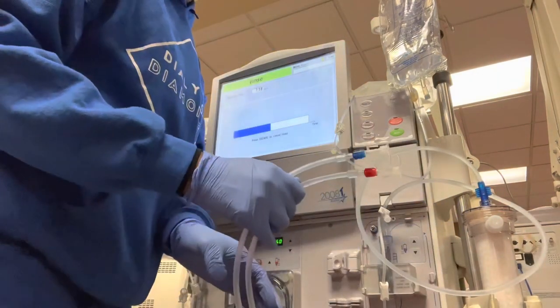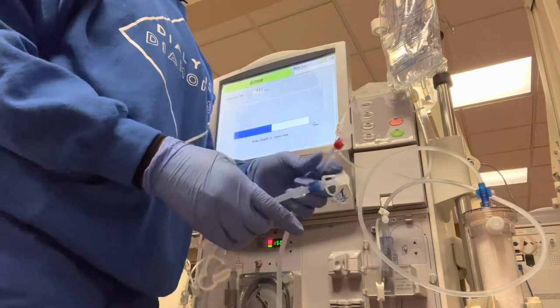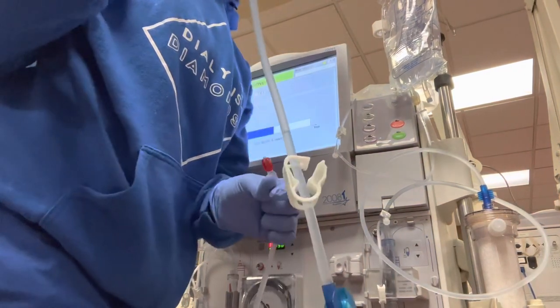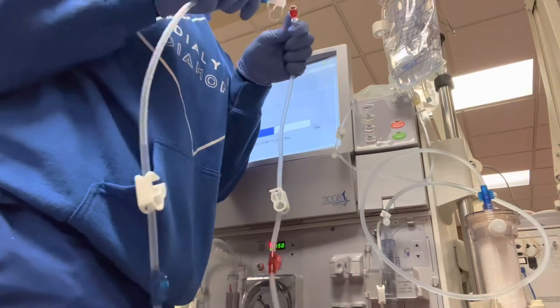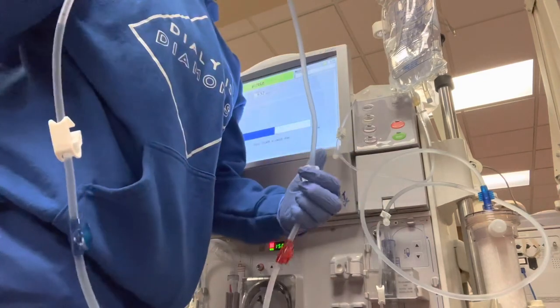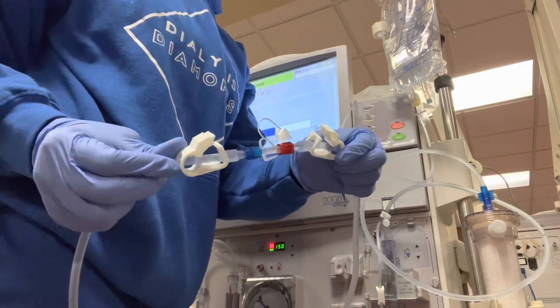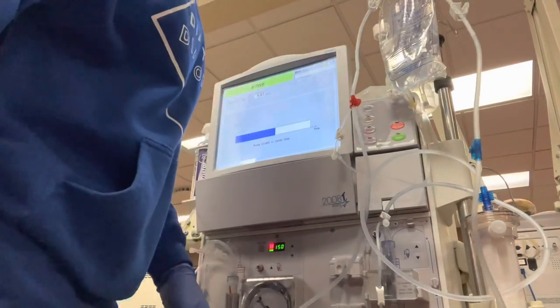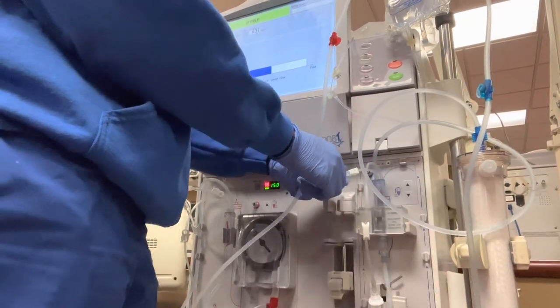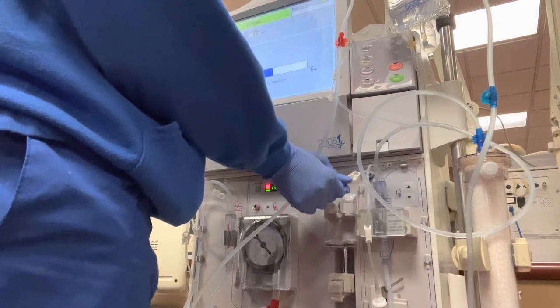So it's now primed. Now I marry my venous and my arterial lines together. See that? Venous is still unclamped. Arterial is clamped. Gonna connect them together. Unclamp as soon as I connect. Now they're both unclamped. Gotta get situated so y'all can see. Now I feel my venous chamber. If you don't marry your lines and unclamp both, you won't be able to feel it. Bye.